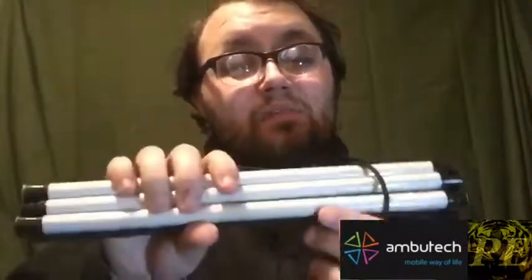This is the cane I've been using for a long time — both of these are AmbuTech products. This is considered a basic five-piece graphite cane with a pencil tip. If I got that wrong, please let me know in the comments. Basically you just use it to tap. This is the one I've been using for about two-plus years and it's been fantastic.